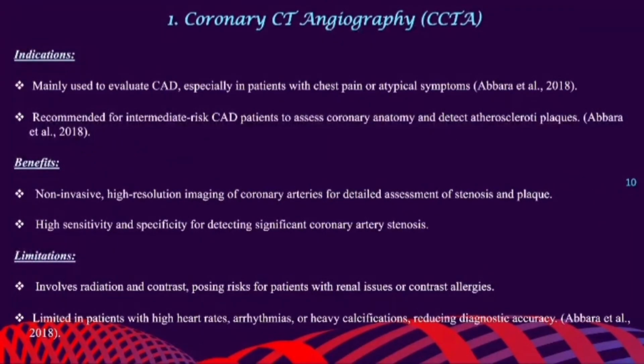Firstly, we have coronary CT angiogram. Coronary CT angiography is a non-invasive imaging technique used to evaluate coronary artery disease in patients with chest pain and atypical symptoms. It provides high sensitivity and specificity for detecting significant artery stenosis and plaque.